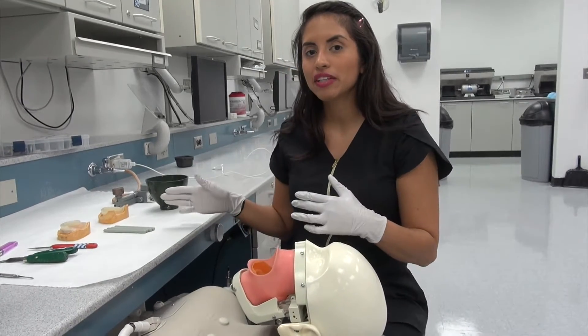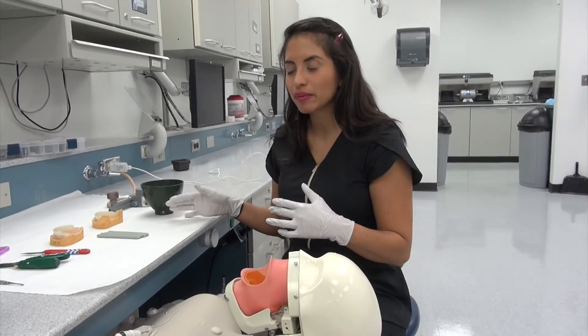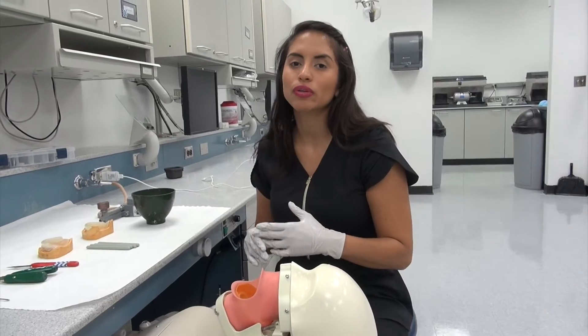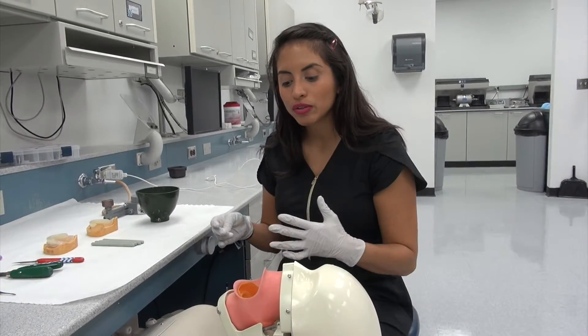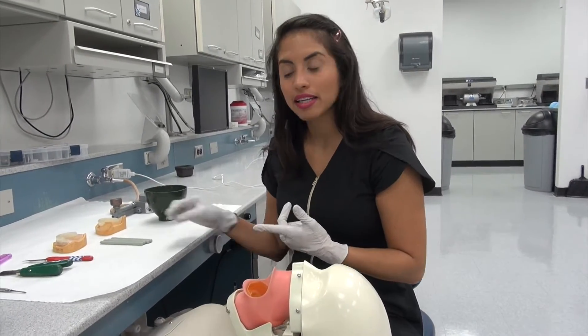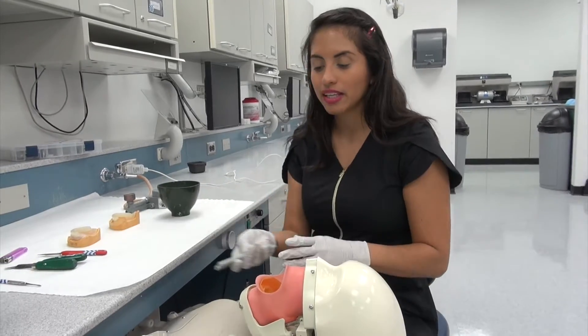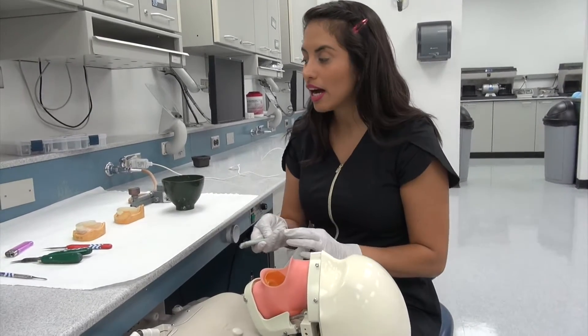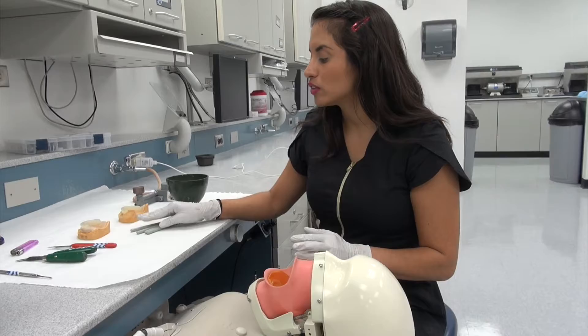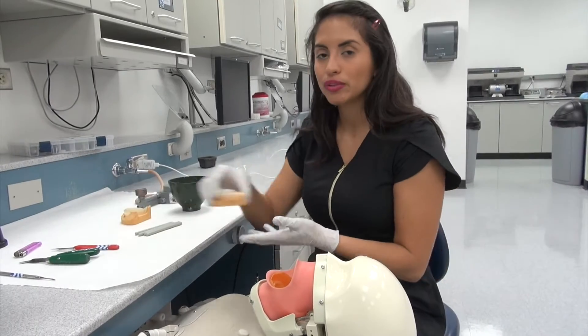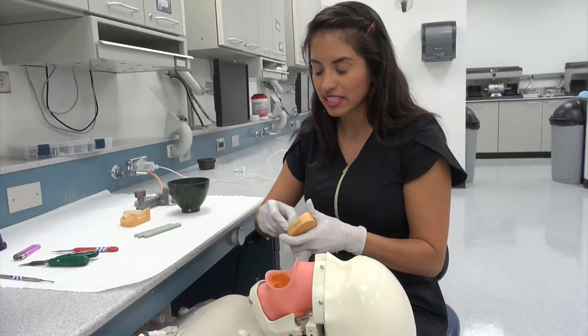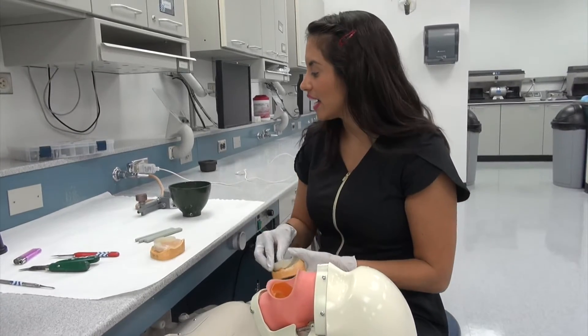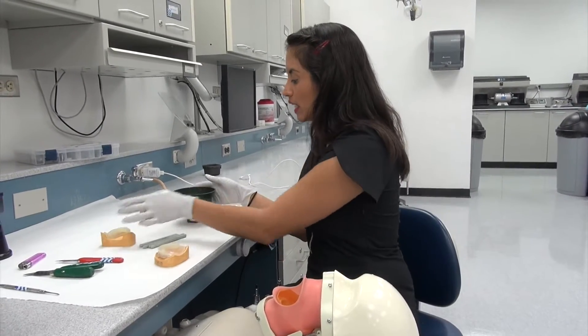We're going to go over a few of the materials that we're going to have today. I'm going to show you how to apply the border molding compound that you'll be given today, how to heat it, how to properly apply it to the edges of your custom impression trays, and how to cool it.